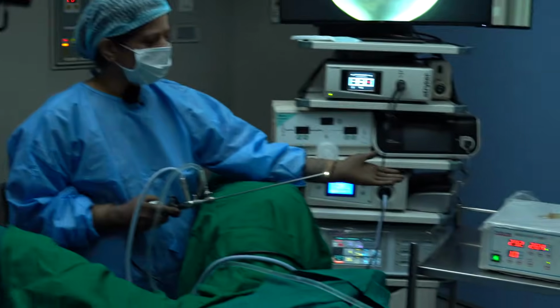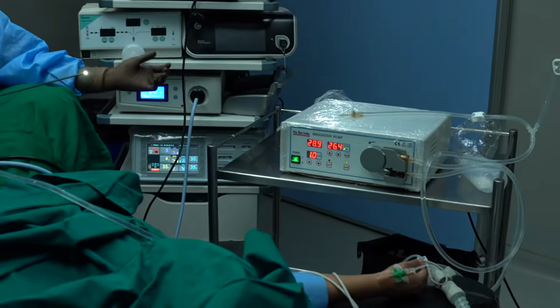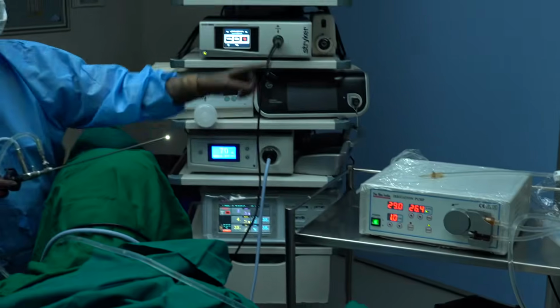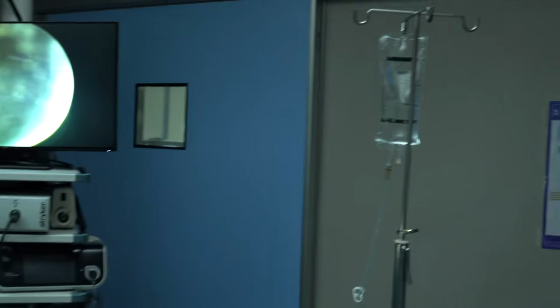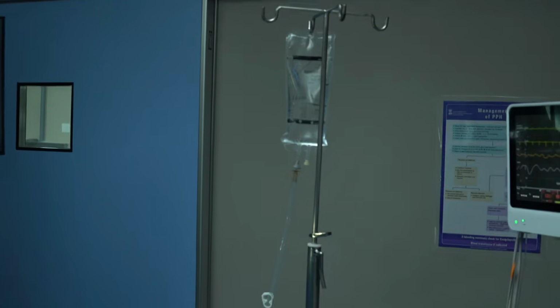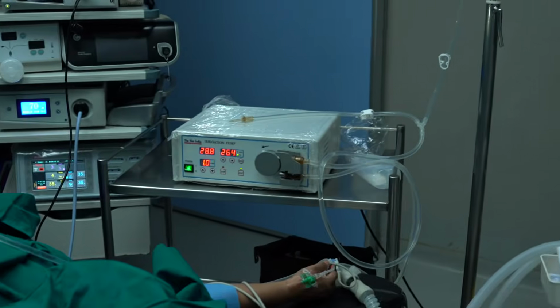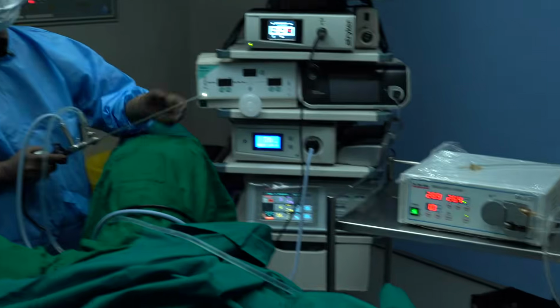This is a hysteromat, which is important to maintain the pressure inside the uterine cavity, where the water will go through that. This is the normal saline, which we call water medically, and that has to enter through this so that the normal saline is pumped into the uterine cavity under pressure.